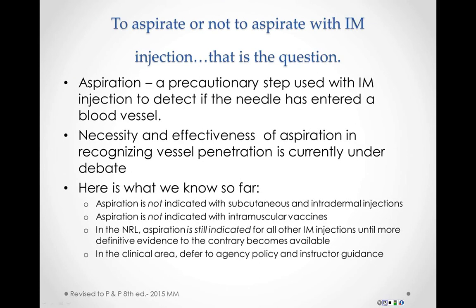To aspirate or not to aspirate with IM injection? That is the question. Let's first define what aspiration is. Aspiration is a precautionary step used with IM injection to detect if the needle has entered a blood vessel.